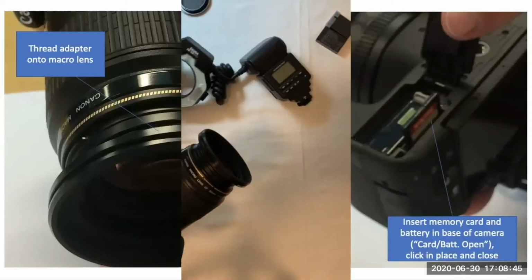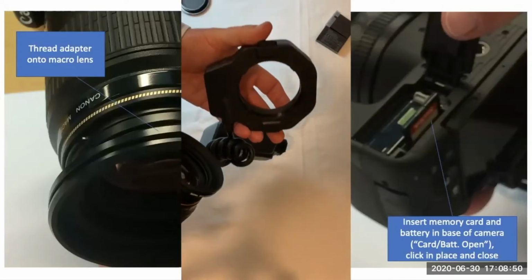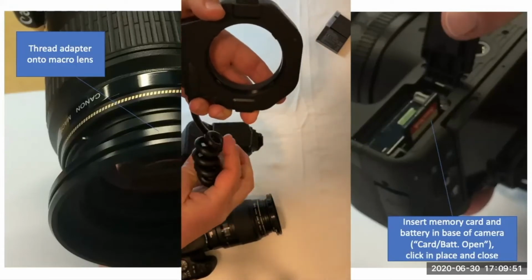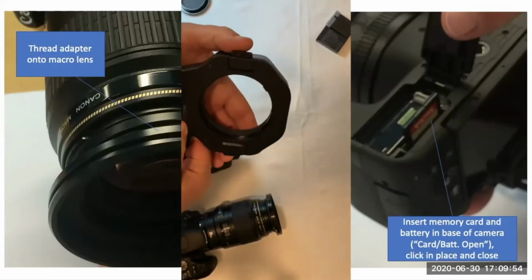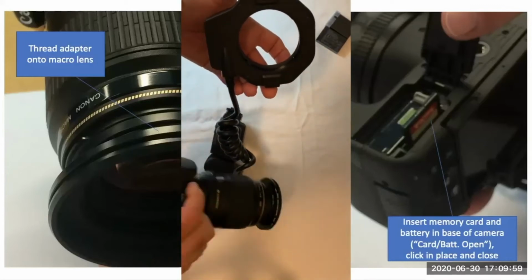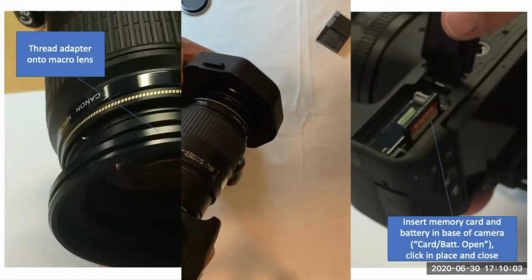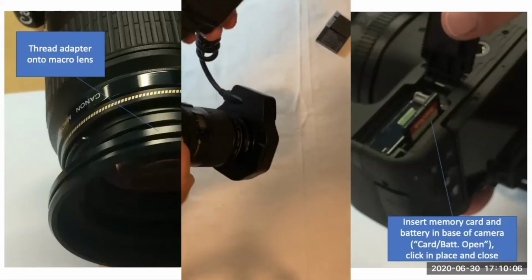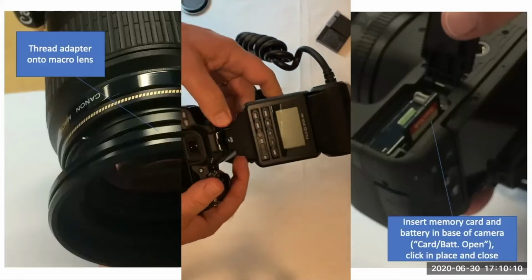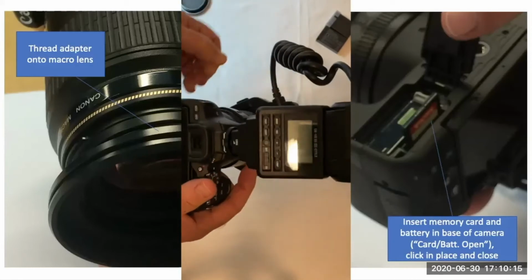Get the main body of the ring flash itself, and there are little bits on the side that you can press in, and as you're pressing them in, it opens up little flanges that are on the inside of the ring flash. Place that in position, let it go, and that'll capture the ring flash. And then you've got to slide the body of the flash on the top of the camera and screw it up tight so that it's locked into position. Not too tight, but it should hold it in position.